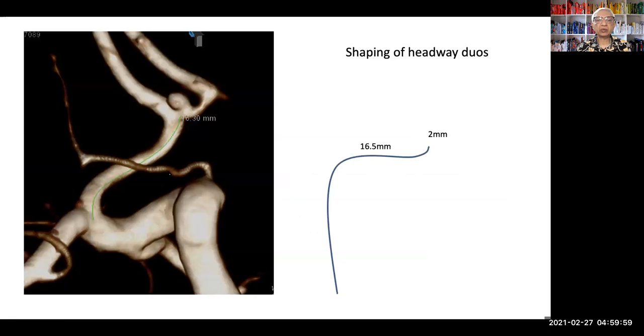Now this is how the aneurysm on the right side was treated. Normally, I would have used a Cat5 in this case through a long sheath like the Infinity. But since we were planning to treat the opposite side using two microcatheters, we decided to take a Navien through the Infinity.